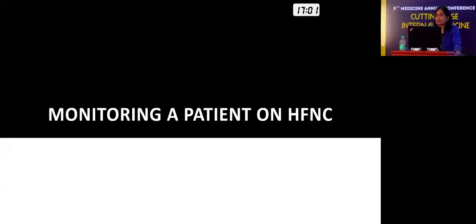How do I monitor a patient on high-flow nasal cannula? You need to do clinical monitoring. I think a lot of focus has to be on clinical. What is the patient's work of breathing? What's their respiratory rate? Is there any asynchrony, thoracoabdominal asynchrony? If anything like that is present, you know that this patient is probably not doing well.